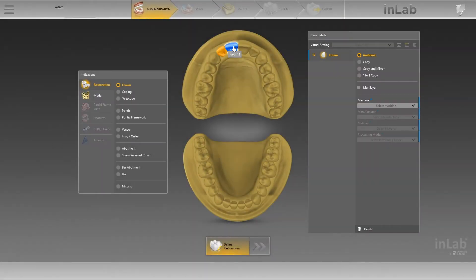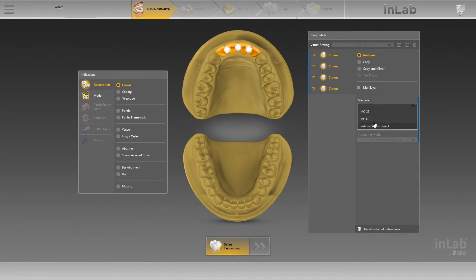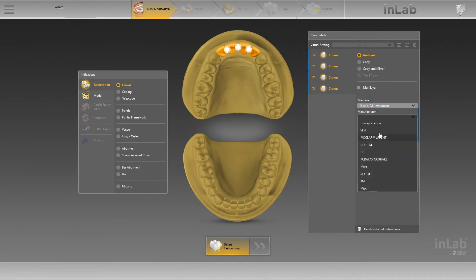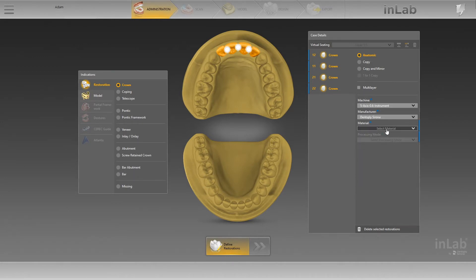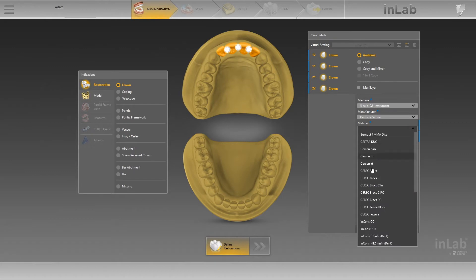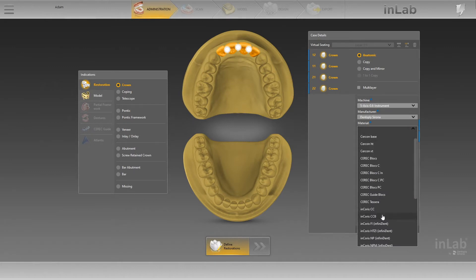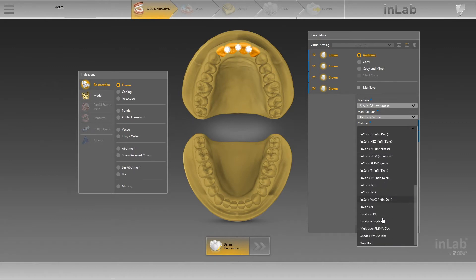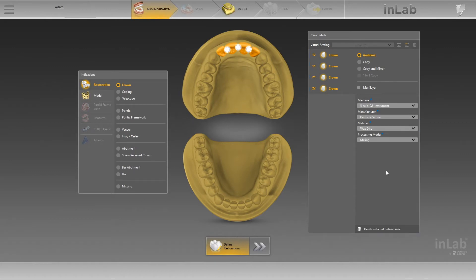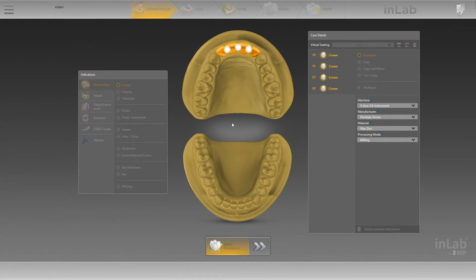Today I'm going to show you how to do zero prep composite edition models within inLab. We're going to select four different restorations — they can be crowns, it doesn't really matter — and we're going to select them as five axis in the administration phase. The material doesn't really matter, it can be anything.